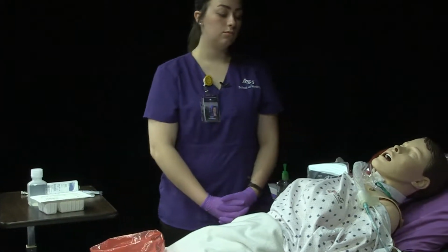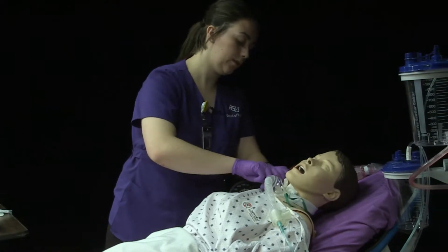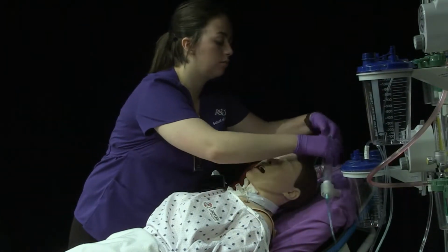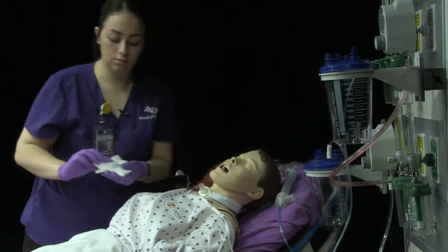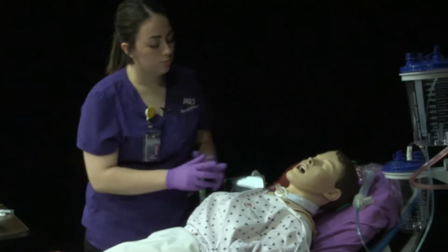Remove tracheostomy dressing and discard per facility policy. And take your oxygen off so I can get to that dressing. Remove your dressing now. Assess tracheostomy site.